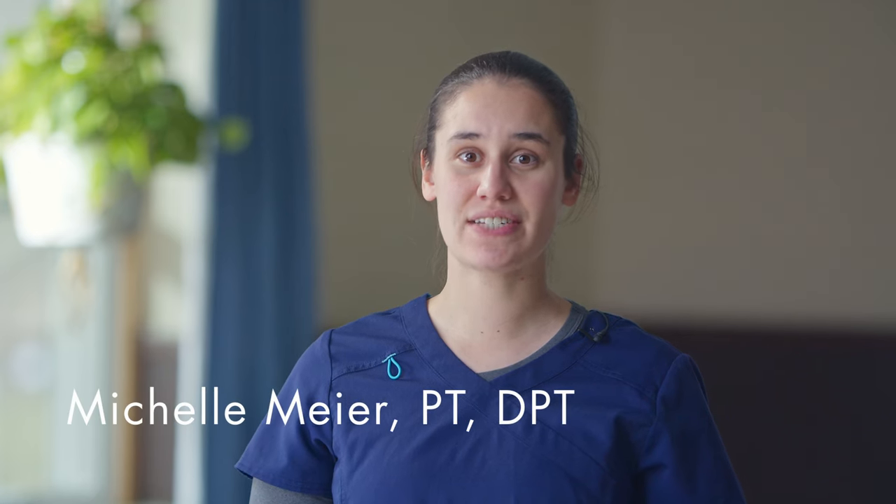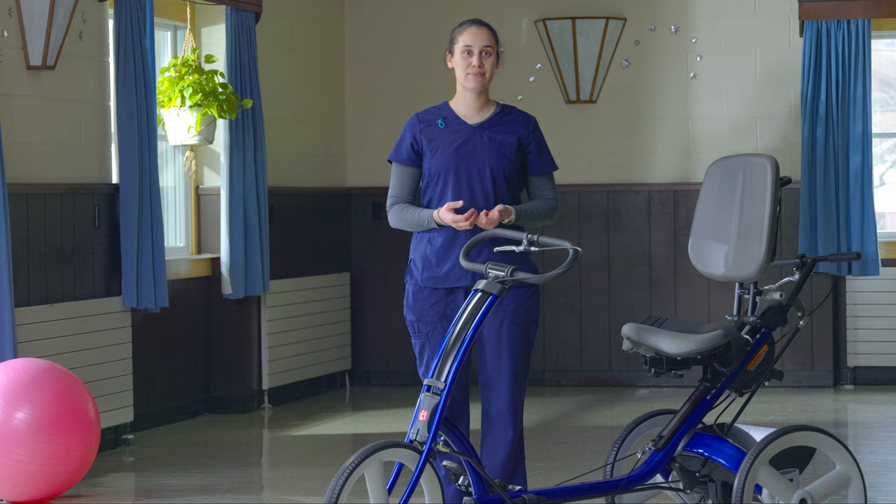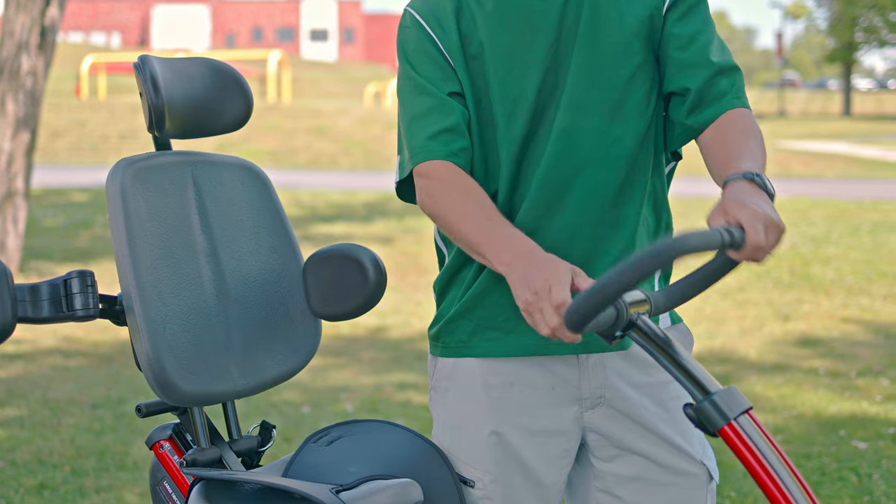For larger riders, transfers onto the tricycle need to be efficient — the less time it takes, the more time we have for cycling. This tricycle is designed to make transitions as simple as possible. The handlebar moves away from the seat as it lowers, and we can flip it out of the way.